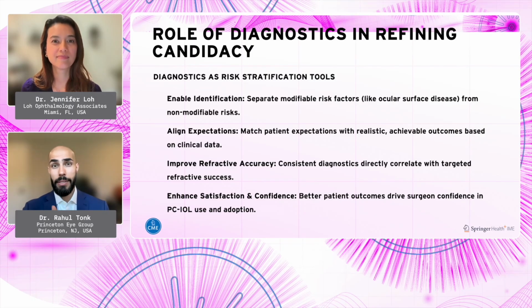If the patient has glaucoma or macular degeneration, you want to be aware of that. A good dilated fundus examination and slit lamp examination can tell you most of those things, but looking through a cataract at a macula is not always the easiest way to pick up subtle macular pathology. So one of my defaults for candidacy is a screening OCT of the macula, which helps me see if there's any macular pathology.